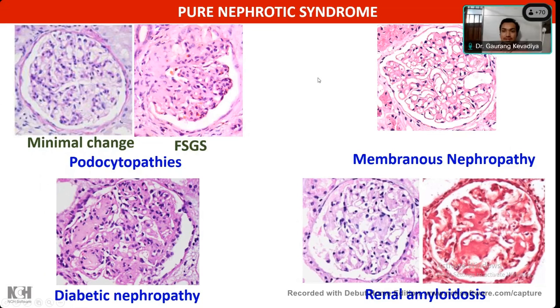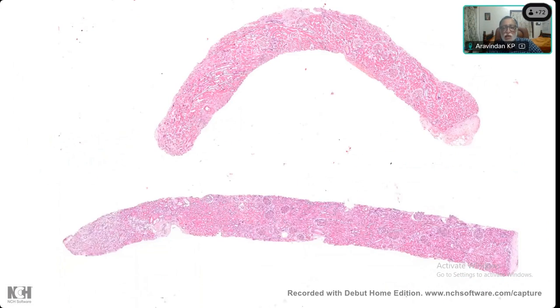So any glomerular injury or membranoproliferative diseases? Yeah. Basically, when there is proliferation, lot of cells and all that. And frequently FSGS also can sometimes show this, but FSGS can be pure nephrotic or it can sometimes have the other features also. So these are the main conditions we're going to look at. And from this case, we will try to find out what it is. Okay? So let's see the slides.